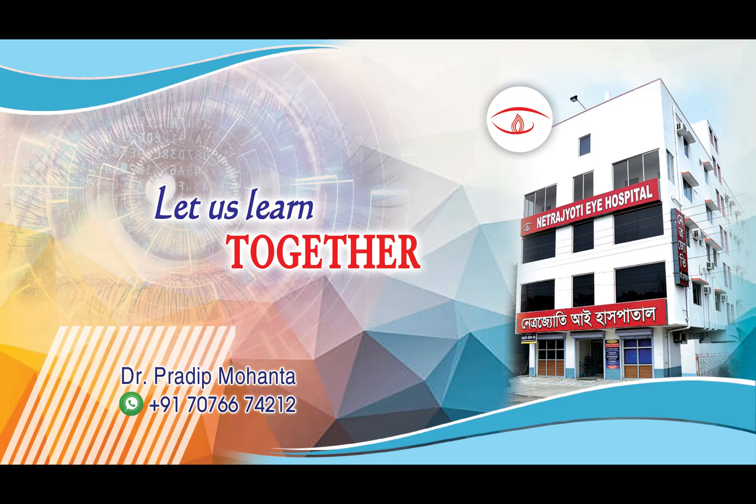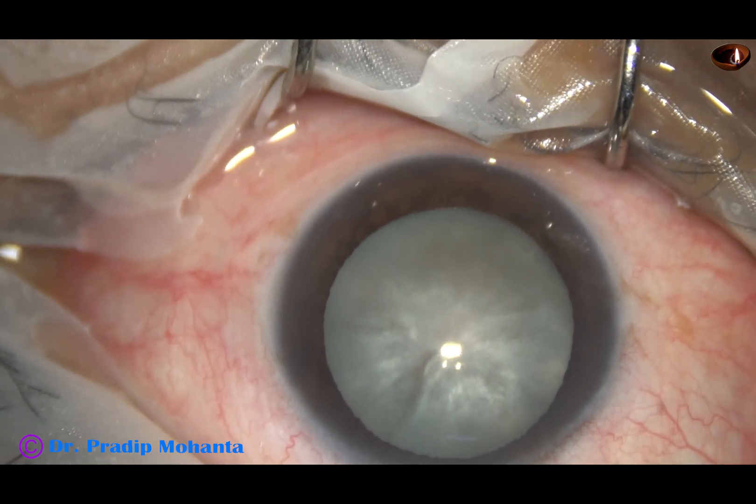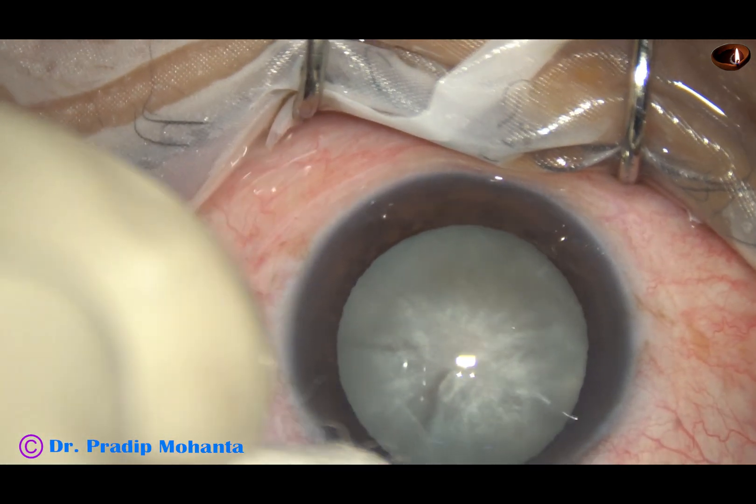Friends, welcome to my workplace at Ranagha to Spengal, India. Let us observe this totally unedited phaco surgery.